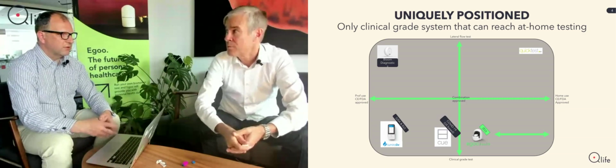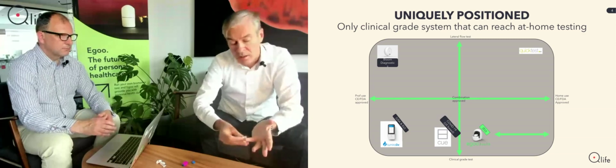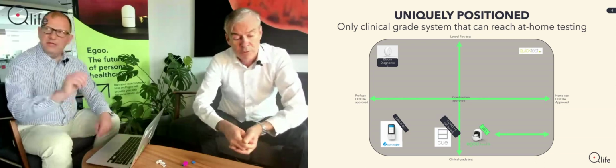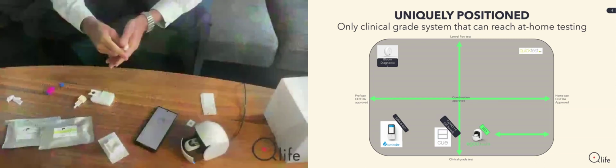That's a big difference. So it's quite difficult actually to get it, but I'm hoping we get it in the relatively near future. So in the meantime, just for the audience, I think the test is more or less ready.